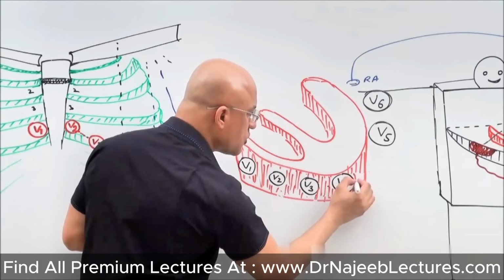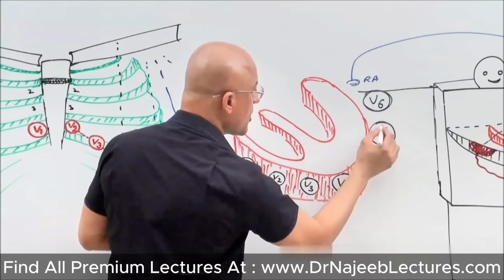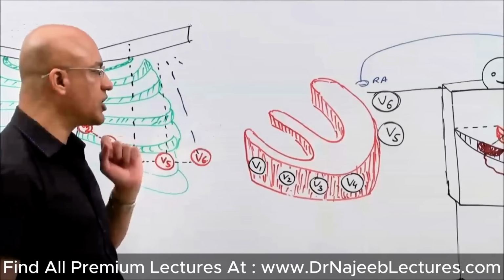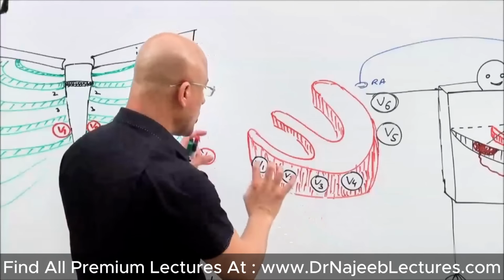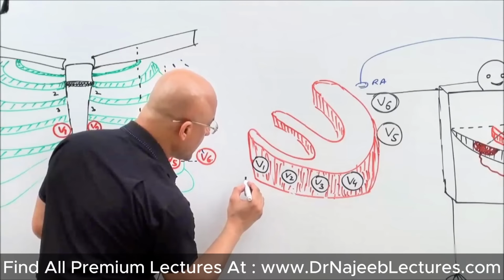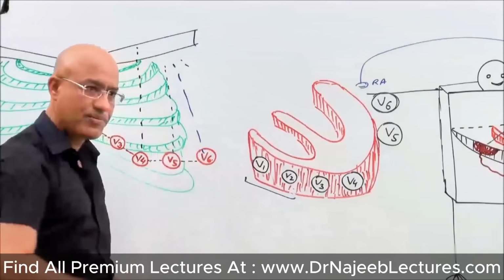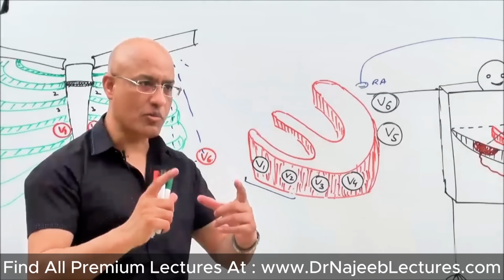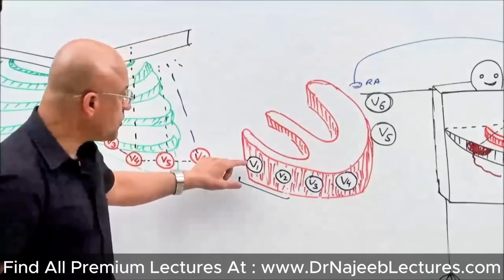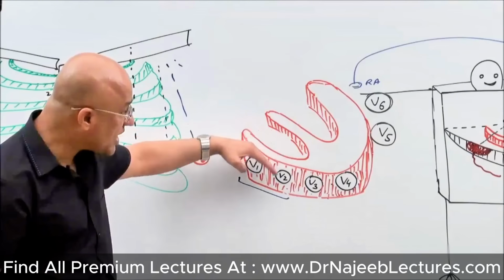Right. Now, this is what I'm showing anatomically, a section of the heart along the transverse plane and the relative position of the chest leads, right? Now, if you look at the orientation of the chest leads, V1 and V2 are oriented to the right side of the heart. I'm talking about anatomically. Anatomically, V1 and V2 are oriented over the right side of the heart.